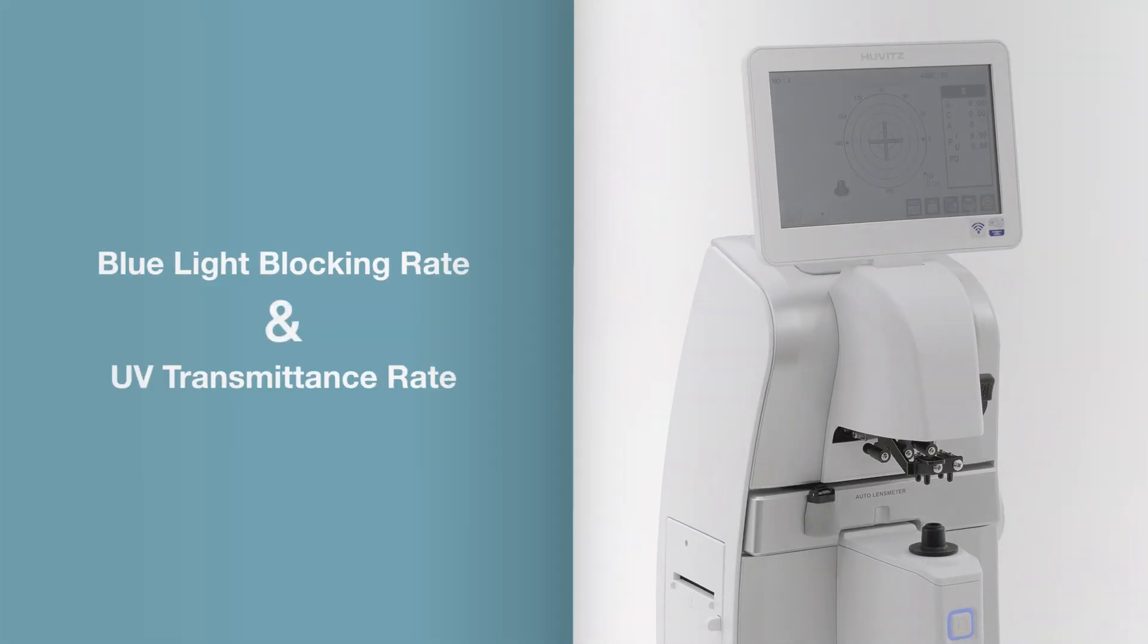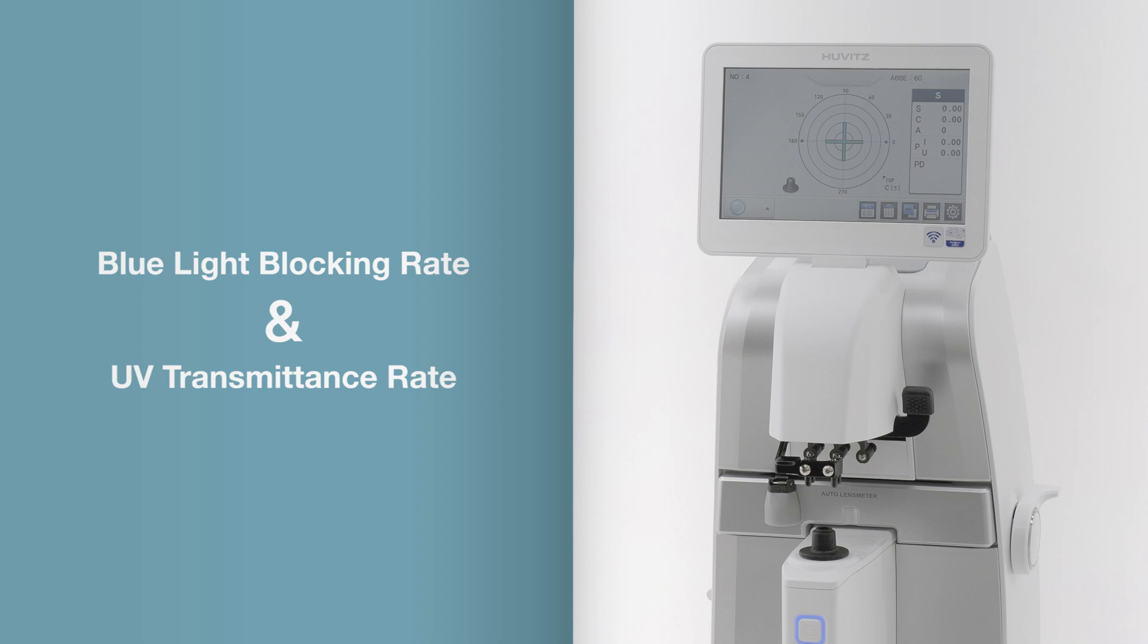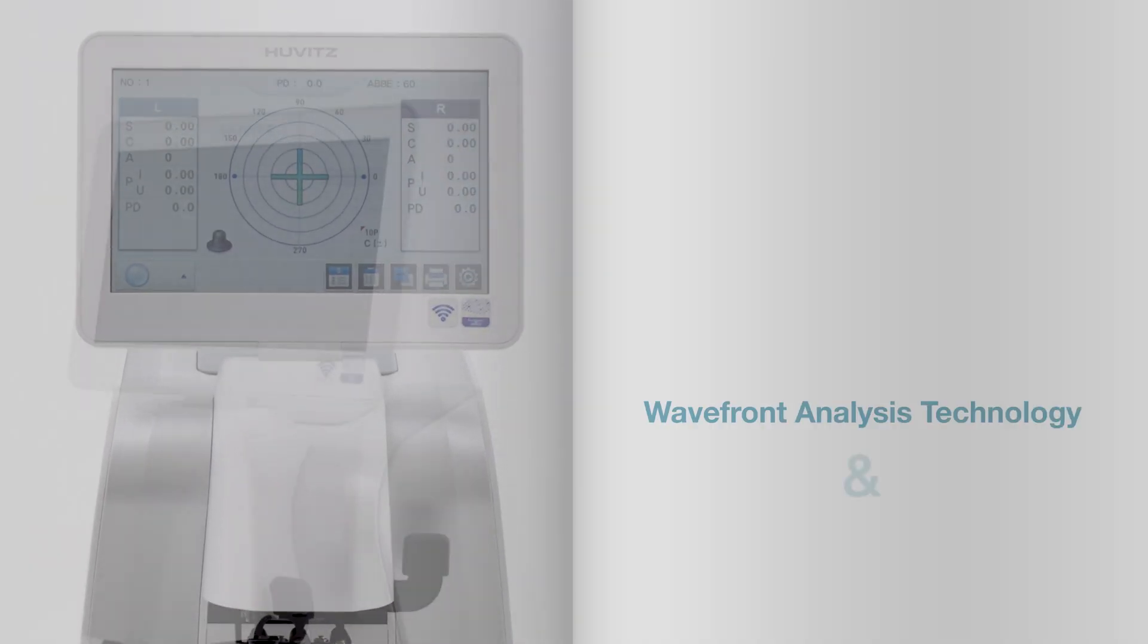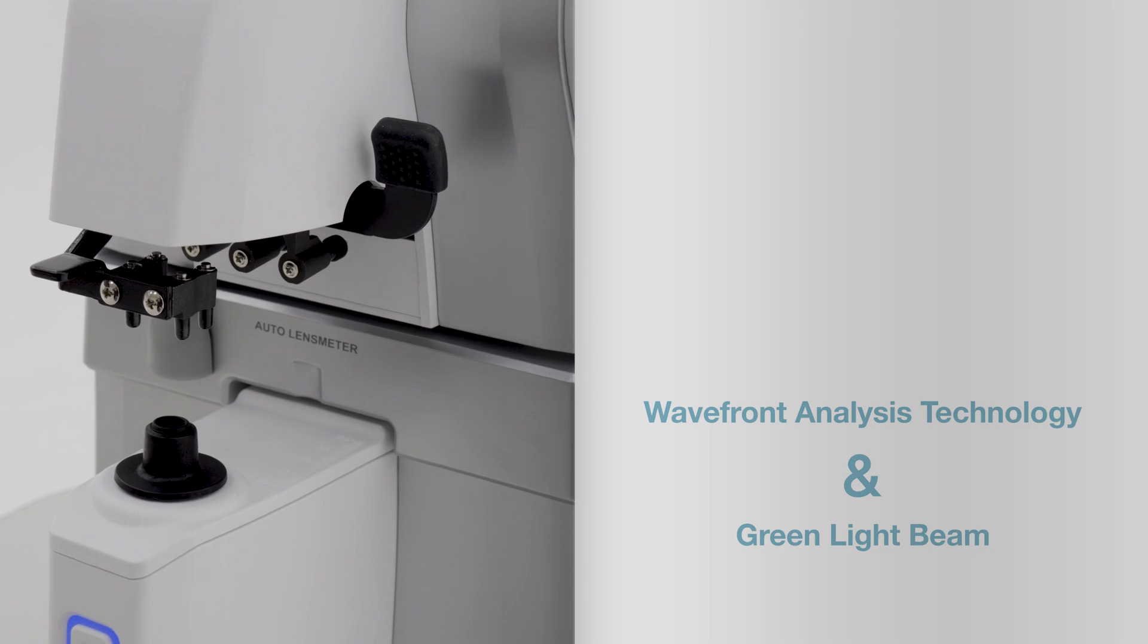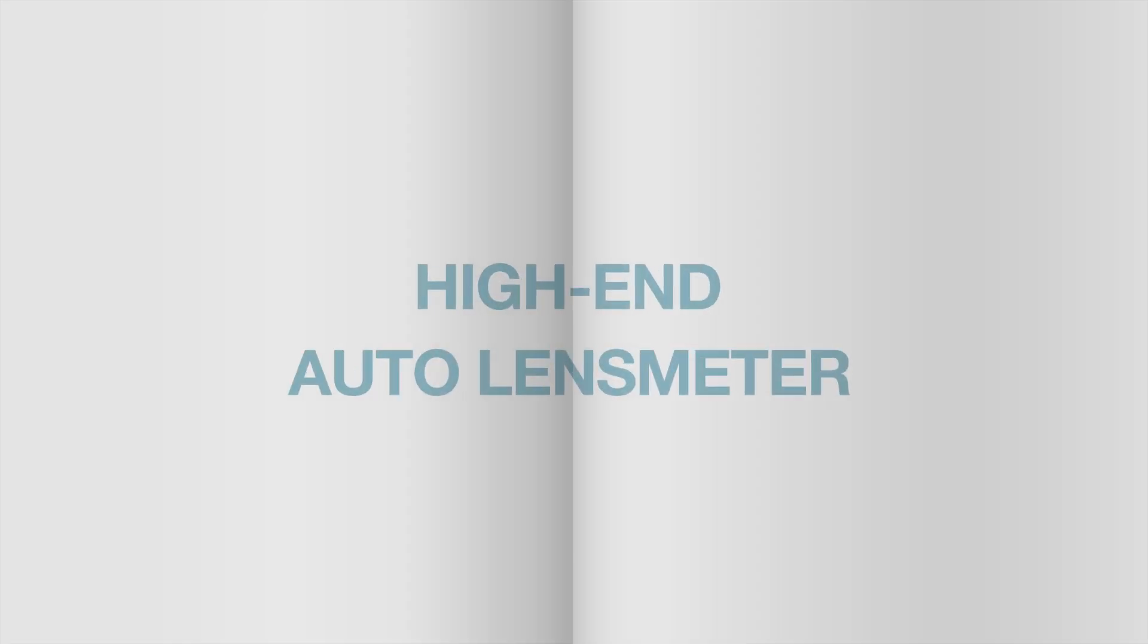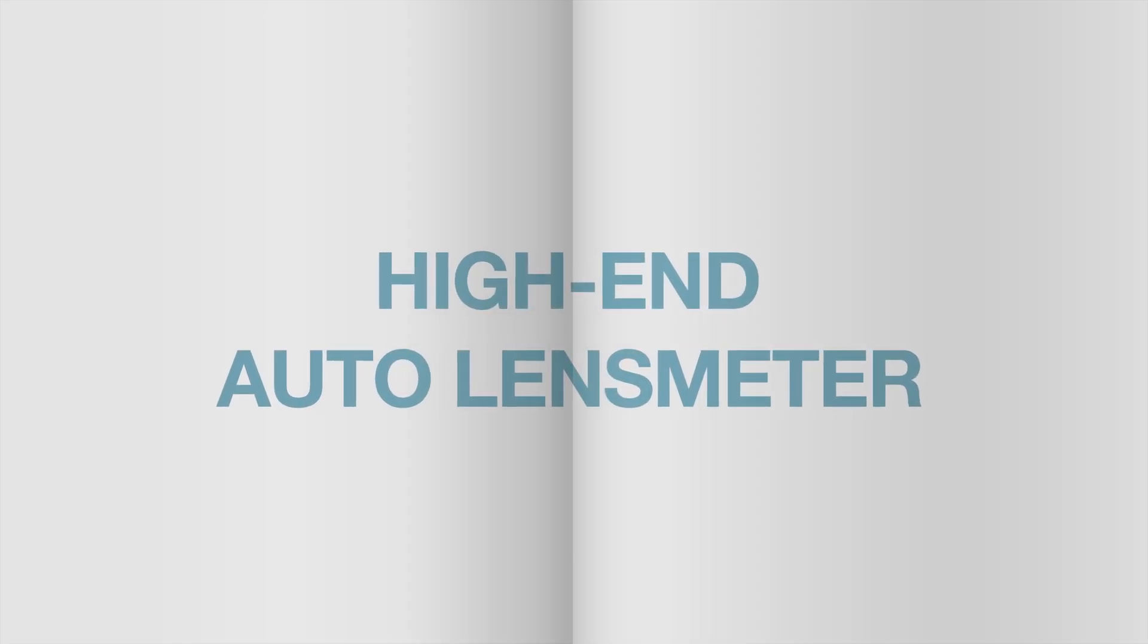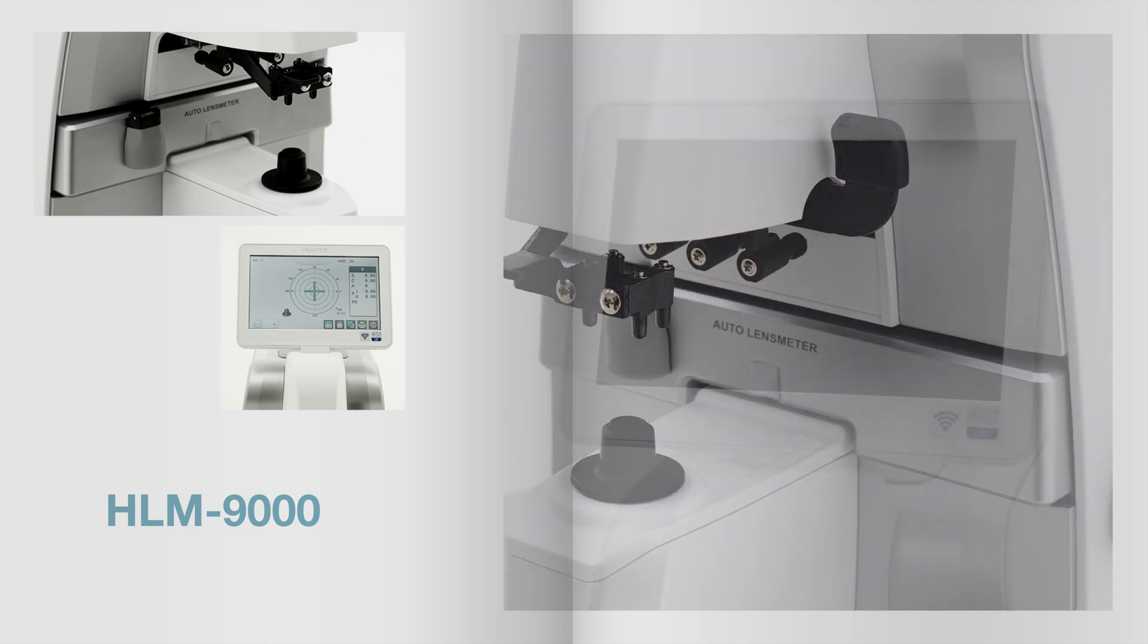Blue light blocking rate and UV transmittance rate can be conveniently measured. While wavefront analysis technology and green light beam are used to accurately measure lens information, this is the high-end auto lens meter, Huwitz HLM 9000.